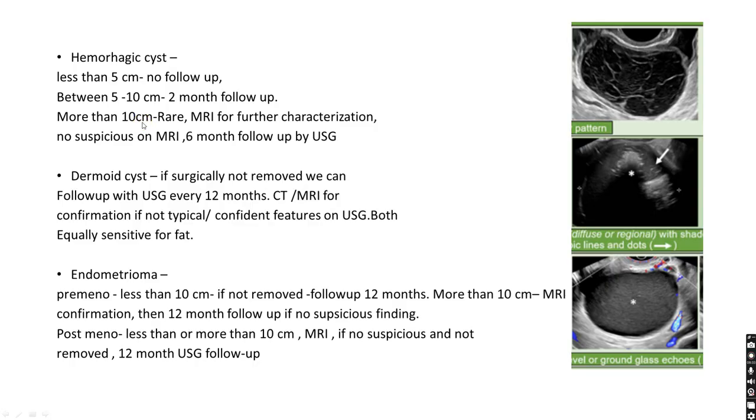But if it is more than 10 centimeter, which is rare, in that case we have to do MRI for further characterization because we cannot see the whole volume of the cyst. So after MRI, if there is no suspicion, then we can do 6-month regular follow-up with ultrasound.